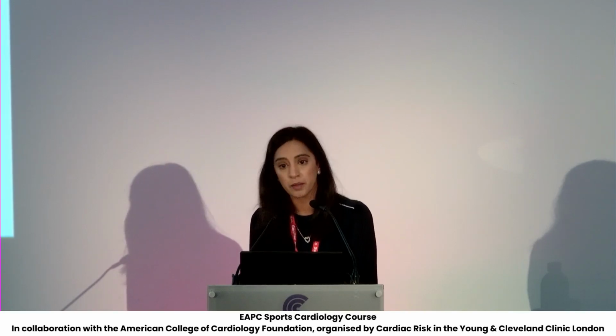I may bring them back for a non-contrast CMR assessment, and if I see a change on that basis, then I may do scar assessment in those individuals. That's how I do it.